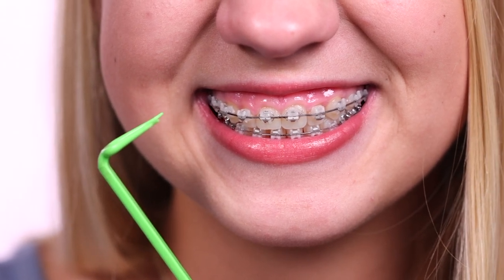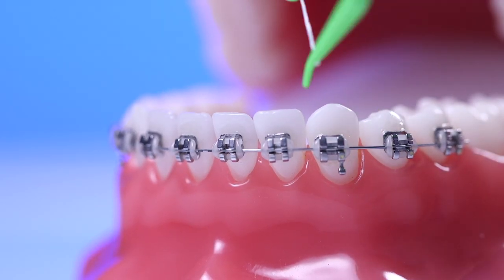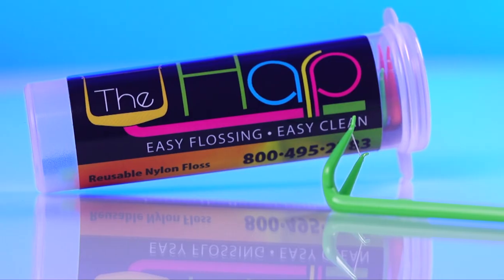Relax your face and smile. Straight teeth are great, but healthy gums and fresh breath are always in style. Try the Harp Flosser for the fun of it. Keep using it for the health of it — it's as easy as that.